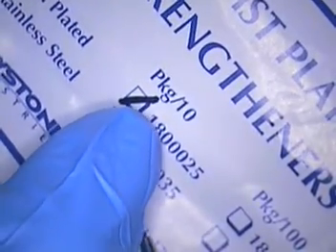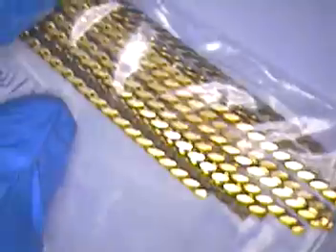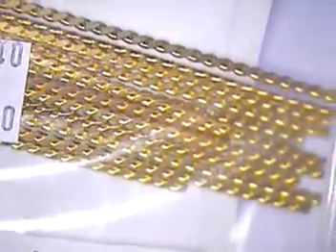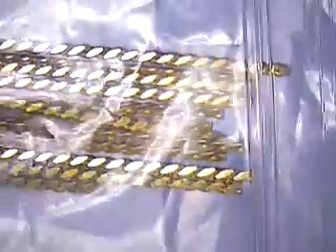That's the actual number and you get a package of 10. They look like this individually and you can bend them to fit. They're very rigid and braided — that's why I like them. You can use them once with one case; I've never reused them. They bend well and don't have a true memory, so you bend them and they stay. We used them to join these analogs together.